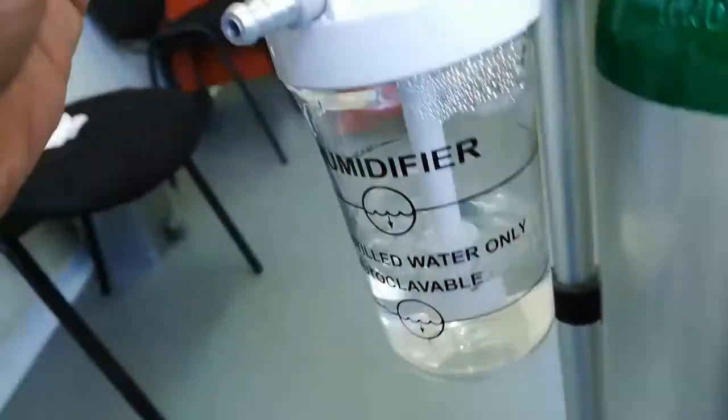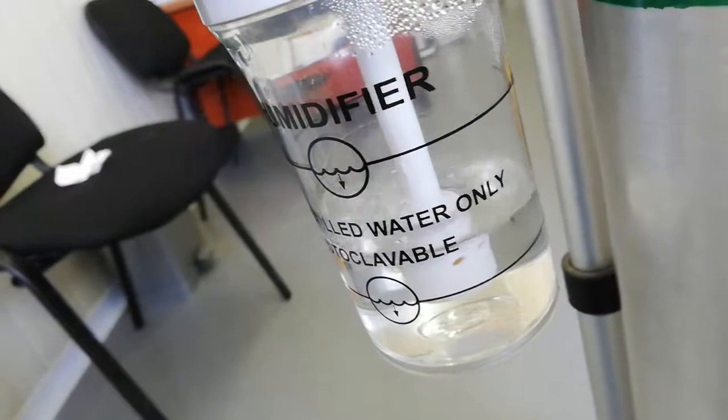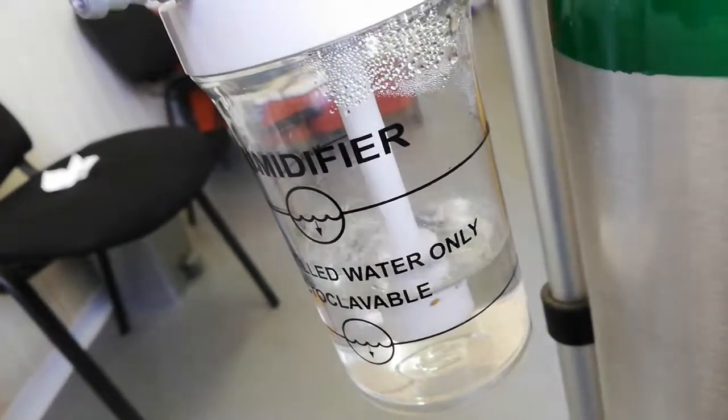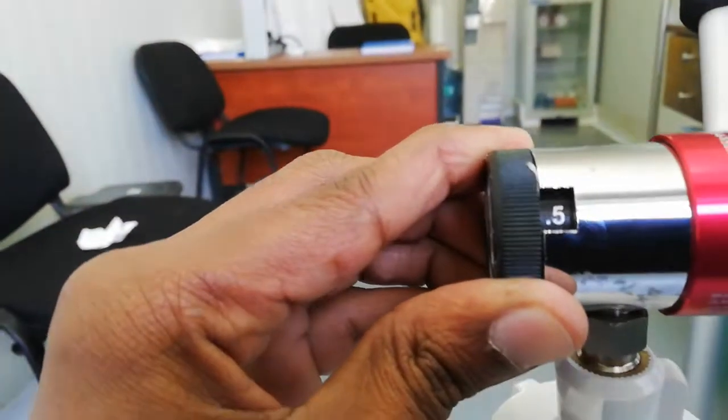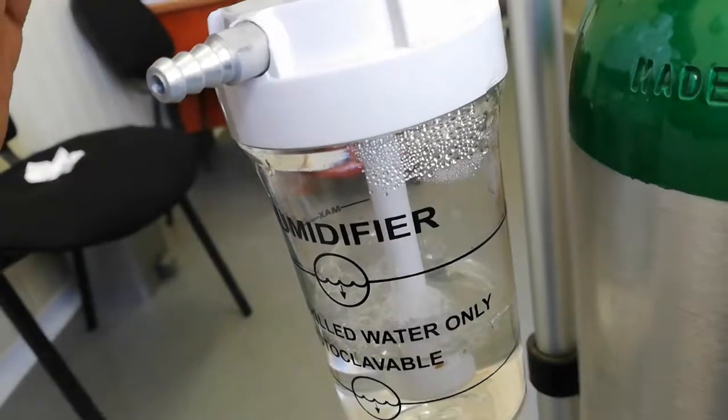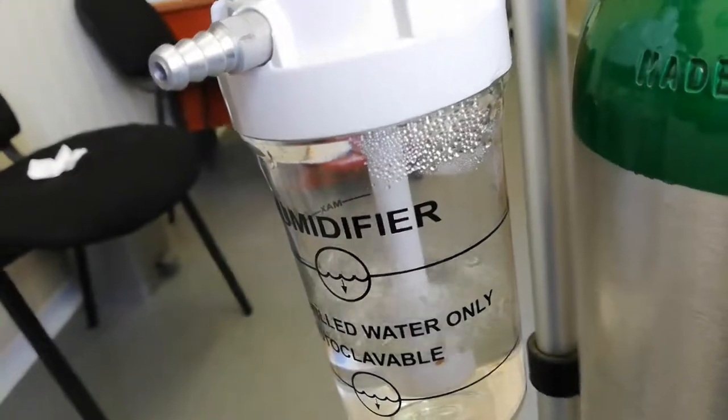4.5 liters. Now there are bubbles in here. We can see bubbles at 0.5 liters, 1 liter, 1.5 liters, and 2 liters.